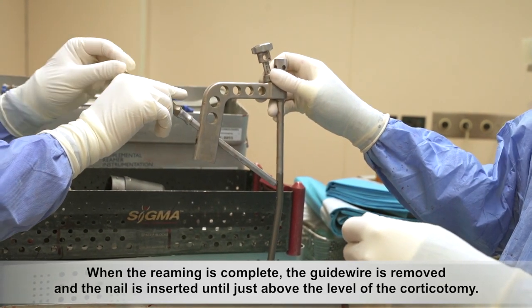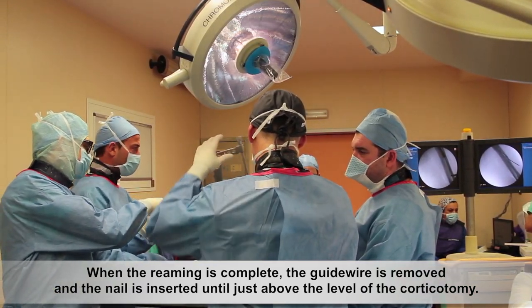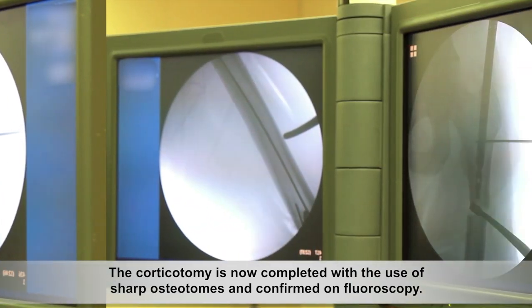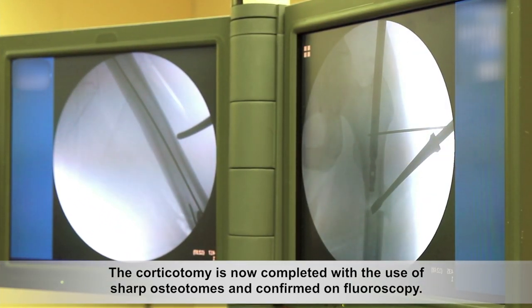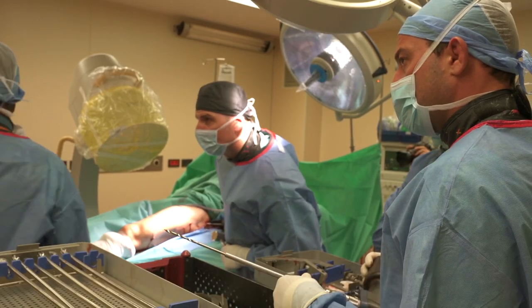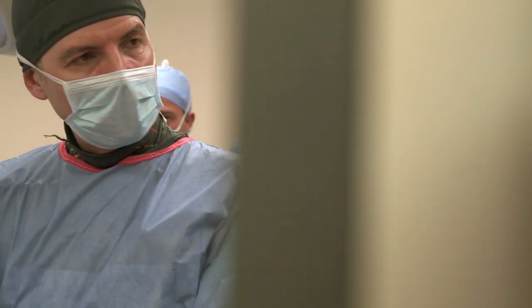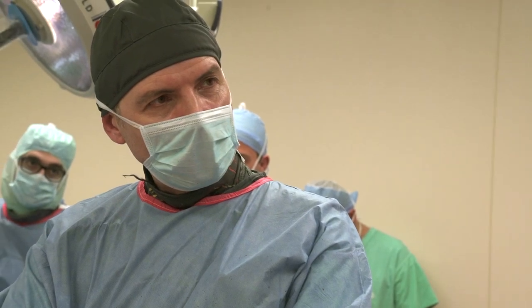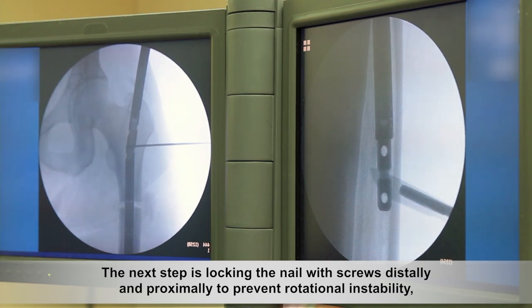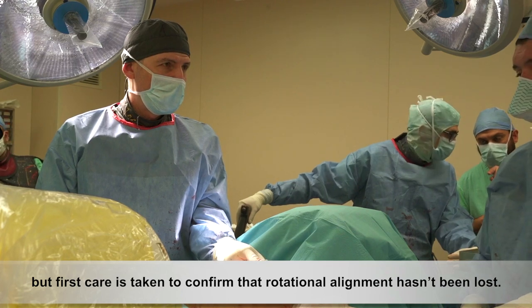When the reaming is complete, the guide wire is removed and the nail is inserted until just above the level of the corticotomy. The corticotomy is now completed with the use of sharp osteotomes and confirmed on fluoroscopy. The nail is then slowly inserted until it sits in its final position. Care is taken to confirm that rotational alignment hasn't been lost.